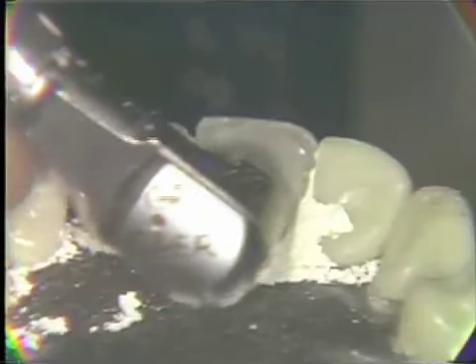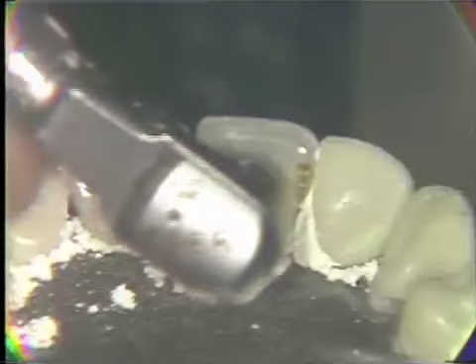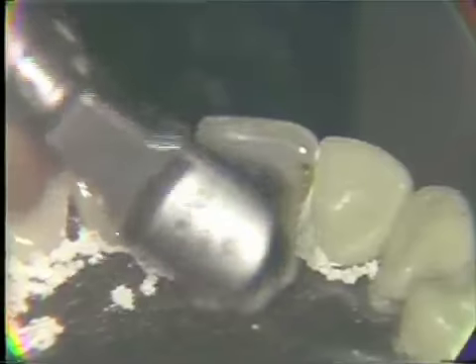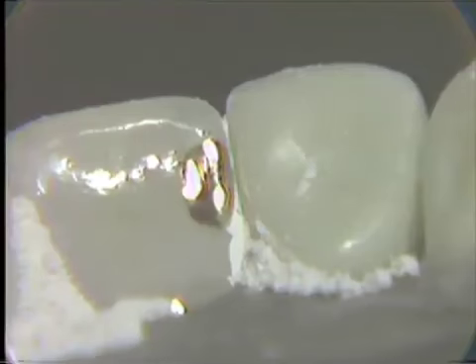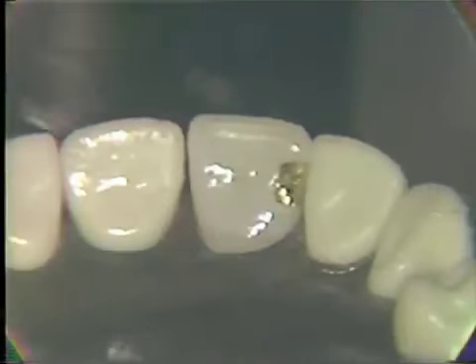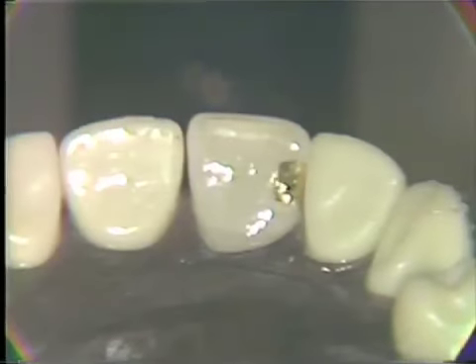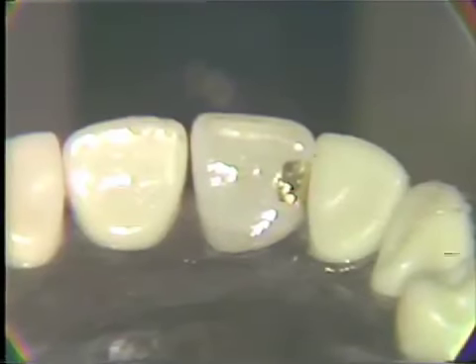We're completing now the finishing of the polishing sequence utilizing the rubber cup and dry tin oxide with a constant stream of air on this. We can then cleanse the field with a stream of water and the evacuator. And then looking at the restoration closely and referring to the criteria for the final restoration.